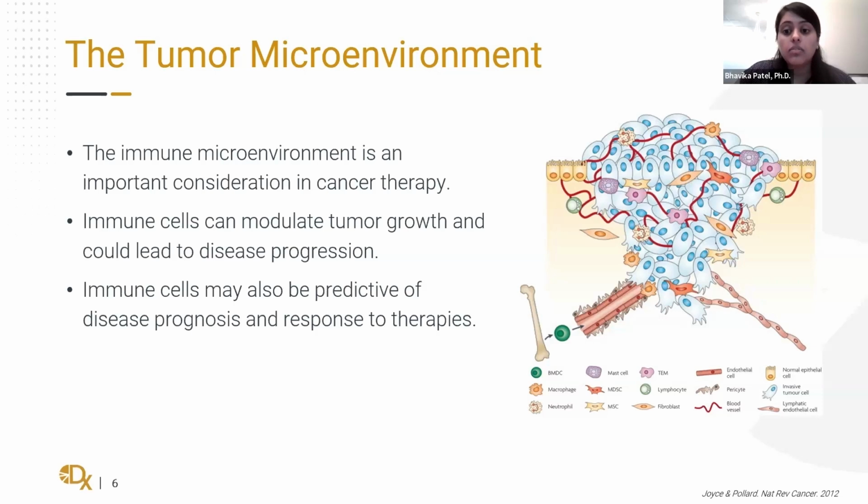Multiplexing gives us the power to visualize several of these biomarkers at once, enabling our researchers and clinicians to quickly interpret the complex phenotypes of the cells that are present within the tumor microenvironment, thus helping advance research discoveries.